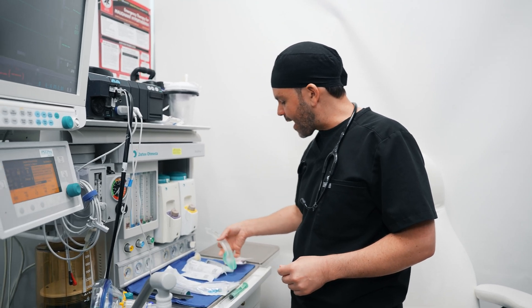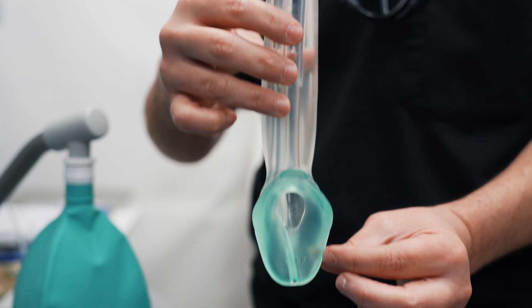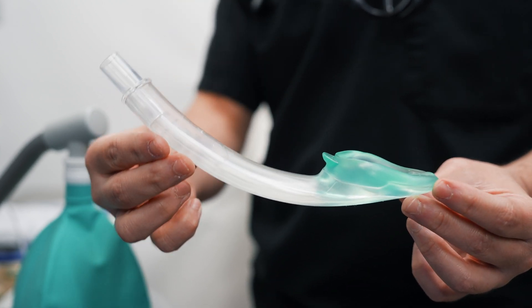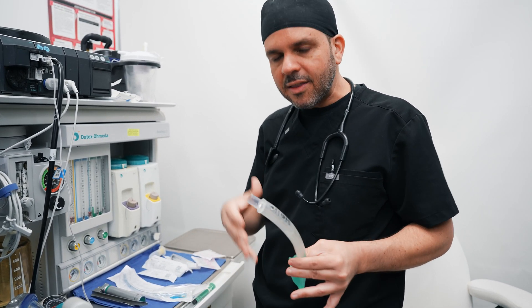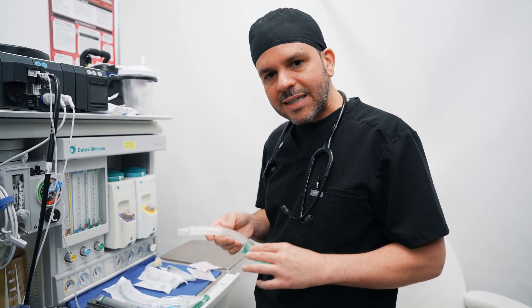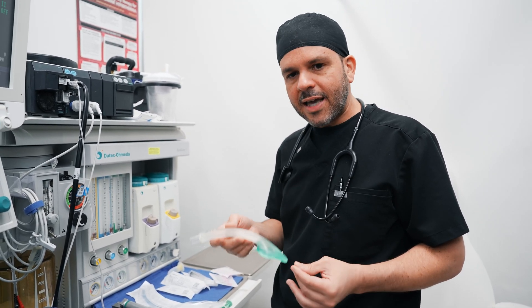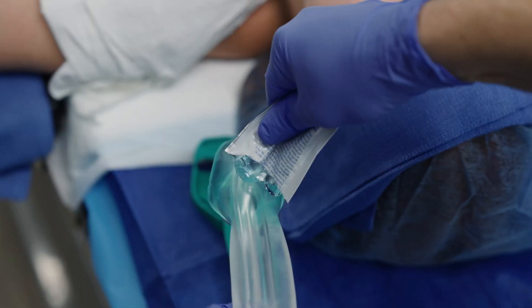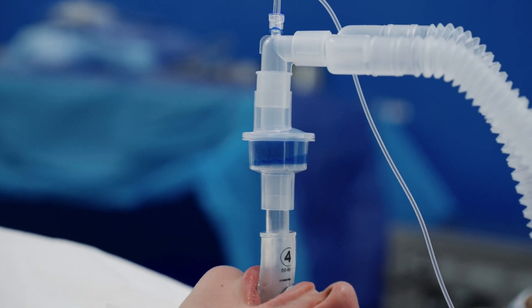I also make sure that I have a laryngeal mask airway, which is another type of device to ventilate you. The difference is this is not considered a secure airway because it doesn't have that balloon that inflates in your trachea to protect it from anything getting from your stomach into your lungs. But it's a very good device and I always have it on hand because it is considered part of the emergency airway algorithm — if I'm not able to insert the tube in a timely manner, I can use this to buy time to ventilate your lungs.